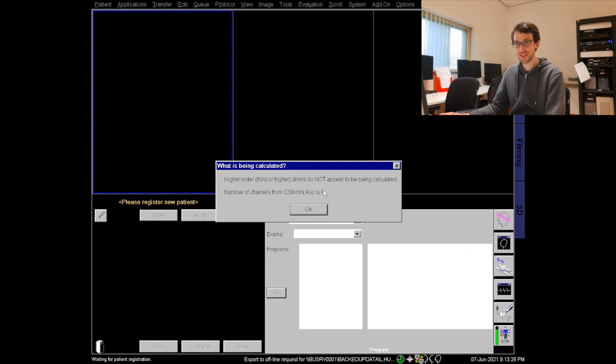When you leave the scanner, it should be 0. And in fact, it should also be 0 when you approach the scanner. If it's not 0 when you approach the scanner, somebody before you screwed up. Please always switch it off after you're done.